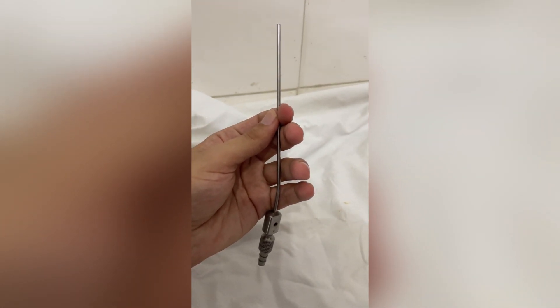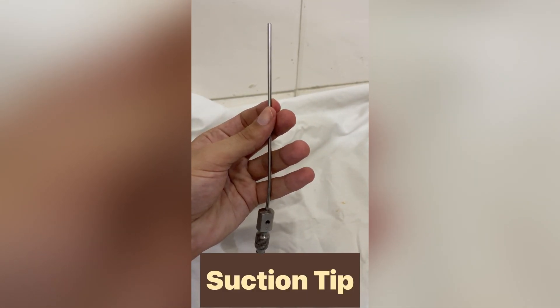This is used to remove fluid collection and other residue from the operating area during surgery.